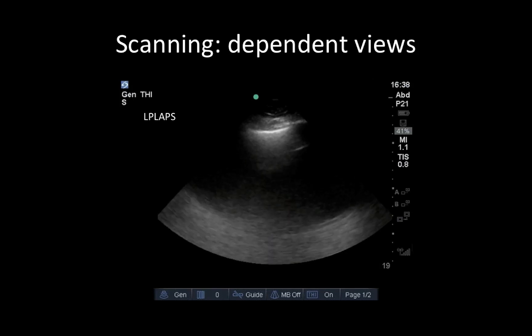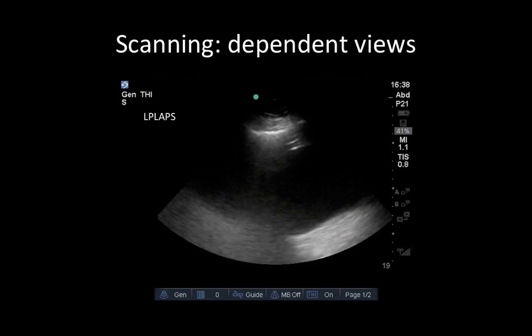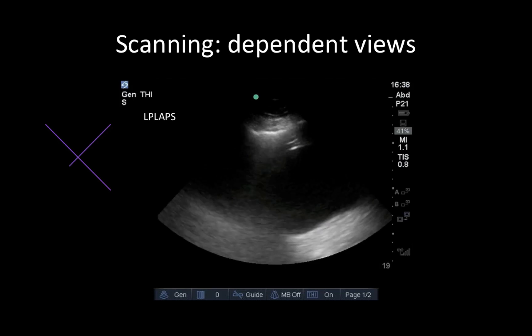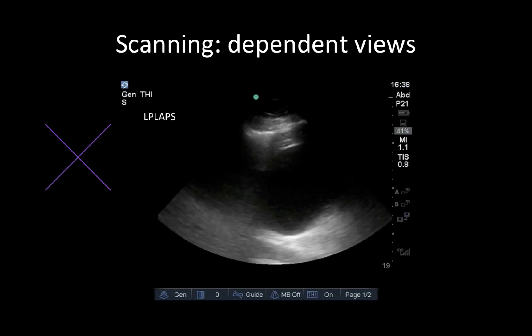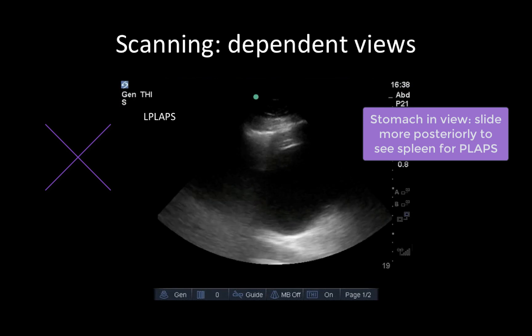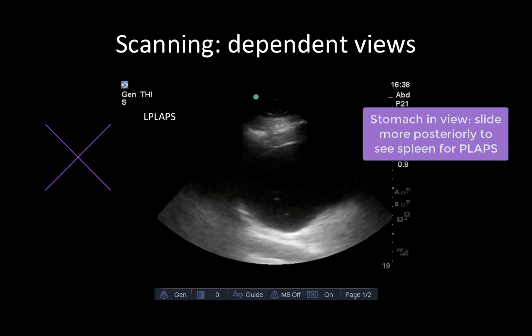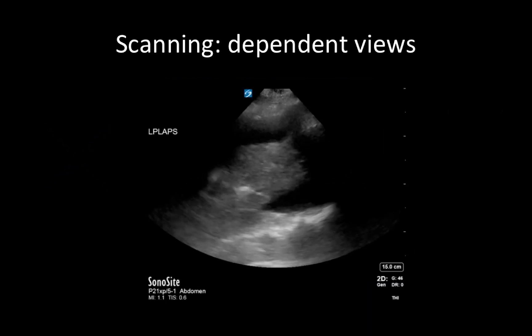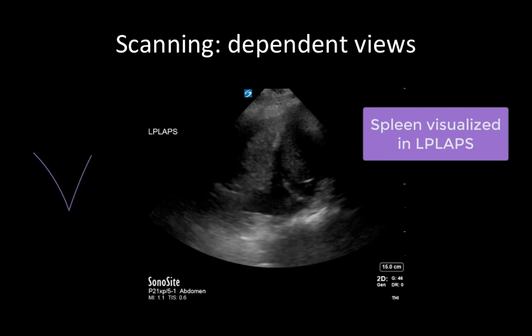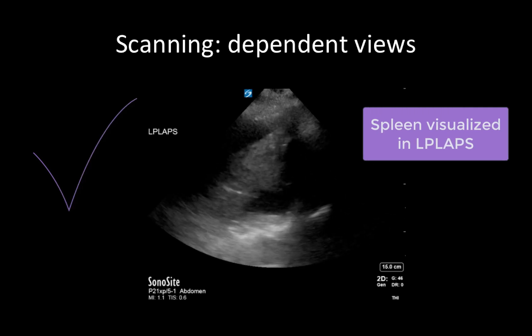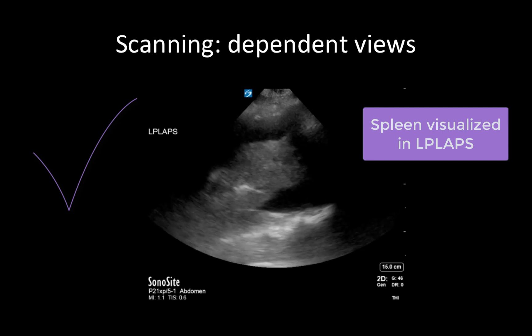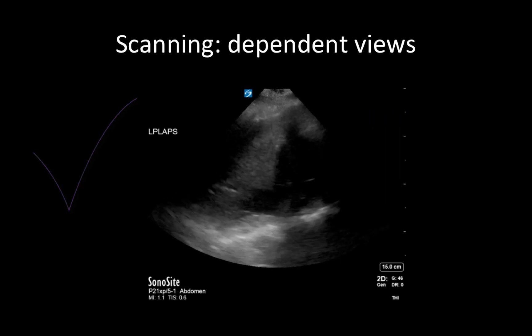The PLAPS view is particularly challenging on the left side, given that the spleen lies more superior and posterior than the liver. If you are visualizing the stomach in your PLAPS view, then your probe is too anterior. To correct this, slide your probe posteriorly and angle into the lung to visualize dependent pathology — in this case, a large consolidated lung and an associated effusion.